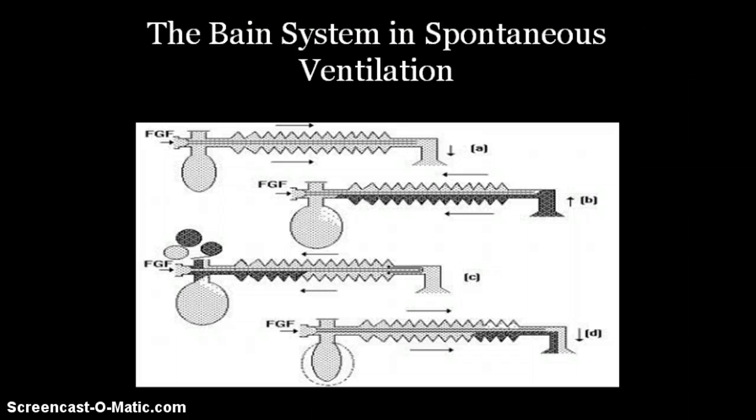During the expiratory pause, the fresh gas continues to flow and fill the proximal portion of the corrugated tube while the mixed gas is vented through the valve. During the next inspiration, the patient breathes fresh gas as well as the mixed gas from the corrugated tube. Many factors influence the composition of the inspired mixture. They are fresh gas flow, respiratory rate, expiratory pause, tidal volume, and CO2 production in the body. Factors other than the fresh gas flow cannot be manipulated in spontaneously breathing patients. Fresh gas flow should be at least 1.5 to 2 times the patient's minute ventilation in order to minimize rebreathing to acceptable levels.